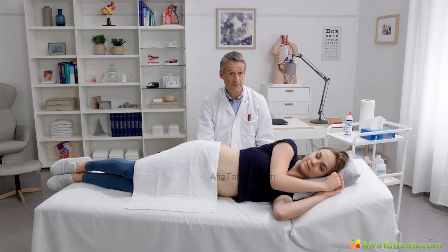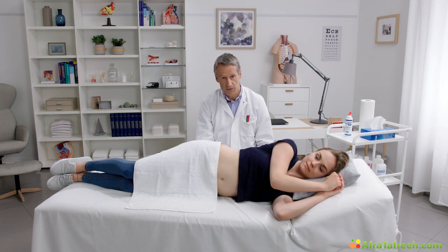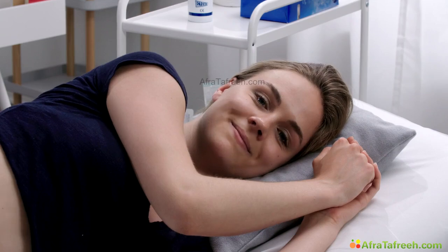We completed the visualization of both kidneys. We can say this young lady doesn't have any kidney stones, no fluid collection within the kidneys, and no renal masses.